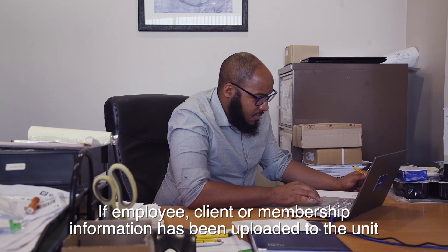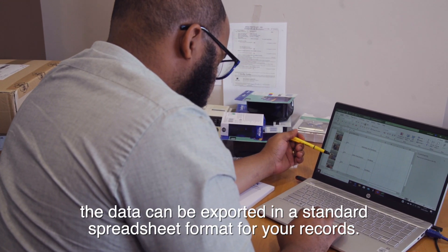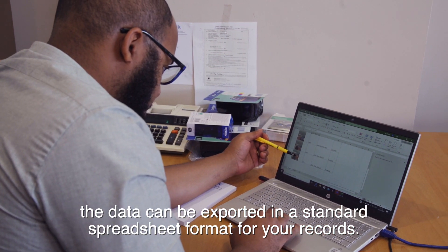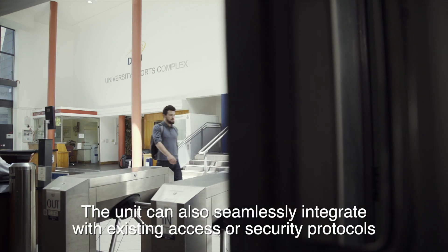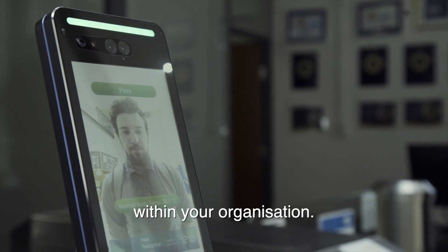If employee, client or membership information has been uploaded to the unit, the data can be exported in a standard spreadsheet format for your records. The unit can also seamlessly integrate with existing access or security protocols within your organisation.